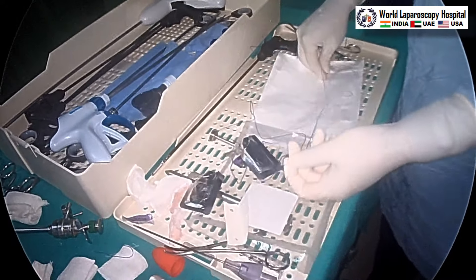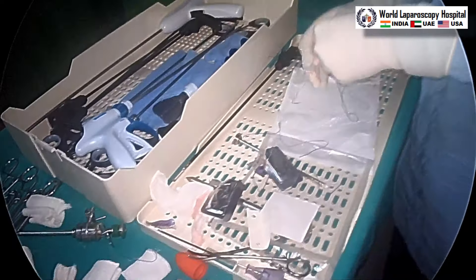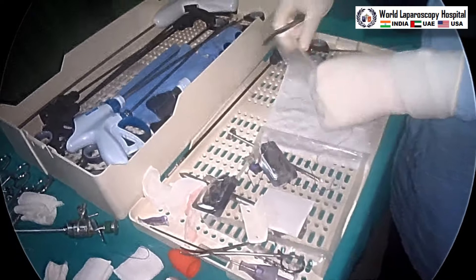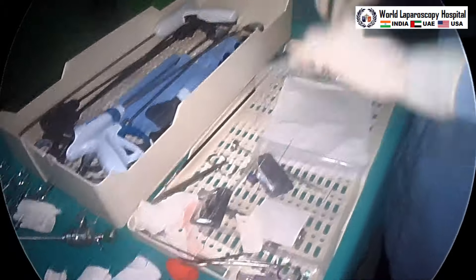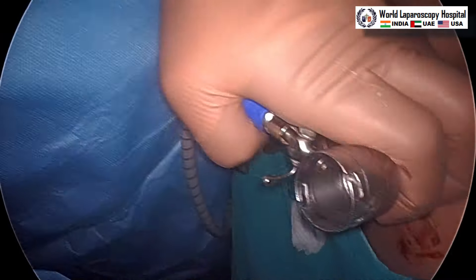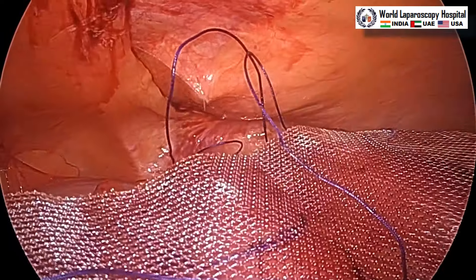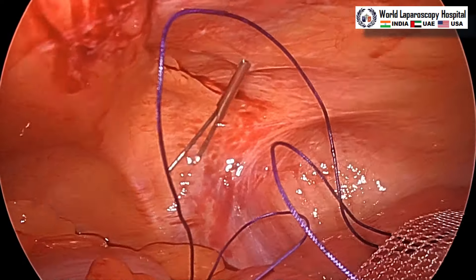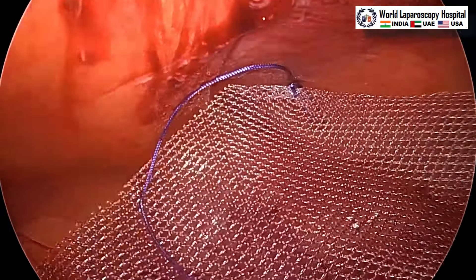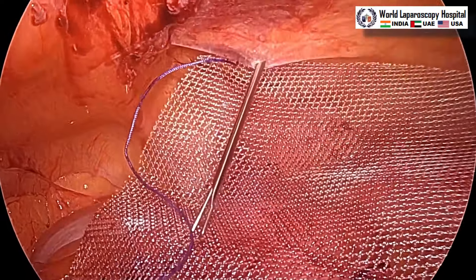Corner sutures are getting tightened — this is the third corner and now applying the fourth corner suture. After that the mesh should be wrapped like a sari-plate and then with a grasper, holding it obliquely, open the valve of the cannula at Misra's point and then the entire mesh can be introduced into the abdomen through Palmer's point. This is the cobbler's needle performing trans-fascial fixation.